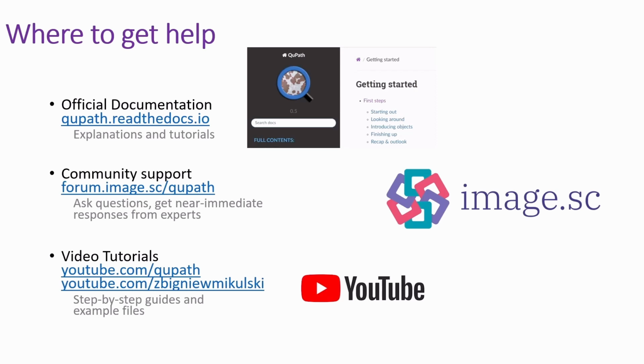There are also video tutorials on YouTube at either youtube.com/QuPath or youtube.com/Zbigniew Mikulski. The ones at QuPath are made by Pete Bankhead directly and are really great. The ones on Zbigniew Mikulski's channel are made by either Z or me. And these are step-by-step guides, and they come with example files and focus on some of the more recent additions to the software.